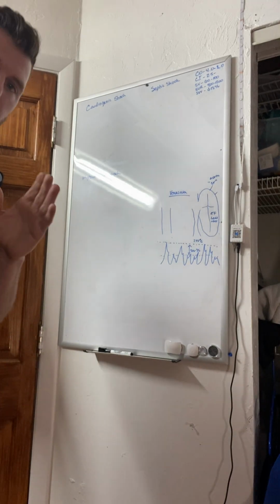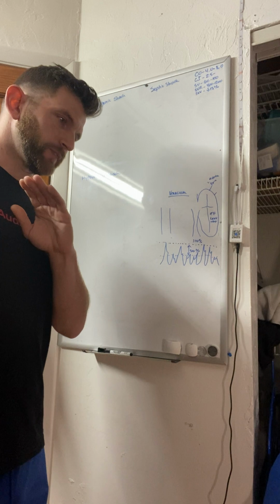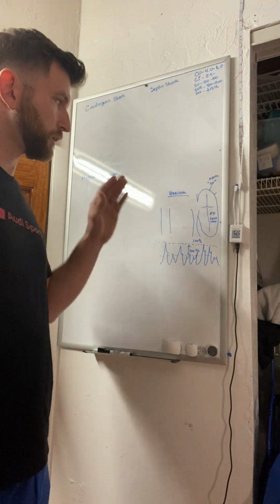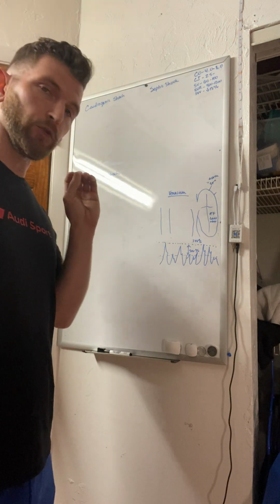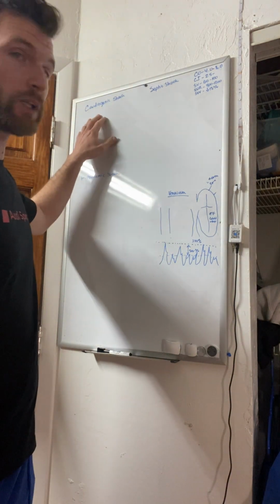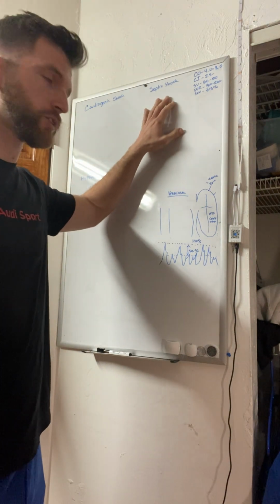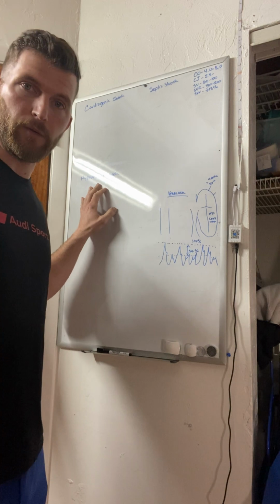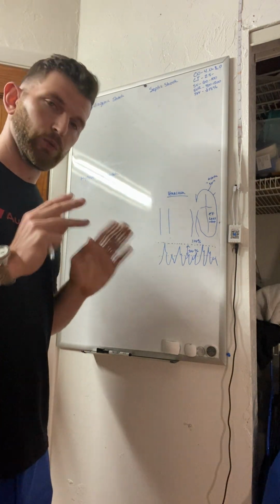All right, I'm gonna give you a quick, simple, nothing super in depth. You look at the Vigileo and you figure out, on a most basic sense, it's either looking like a cardiogenic situation, maybe a septic shock situation, or maybe a hypovolemic situation. The Vigileo is just a tool.